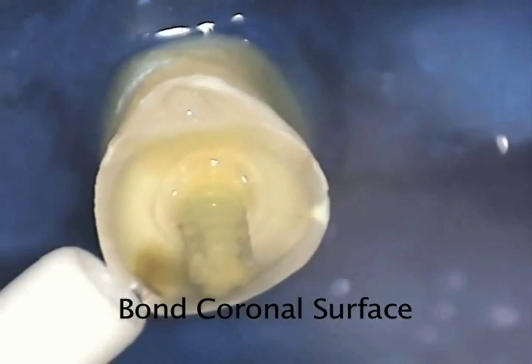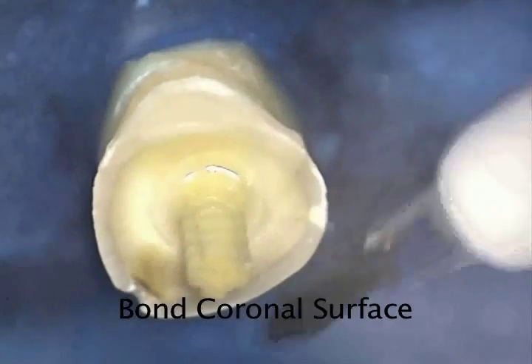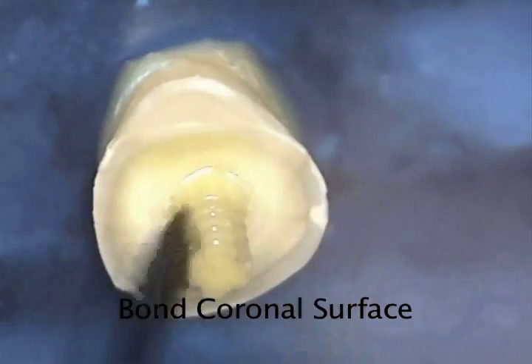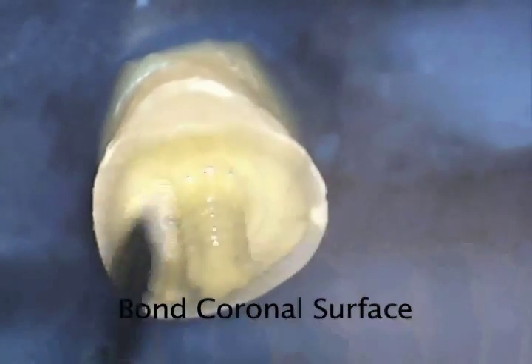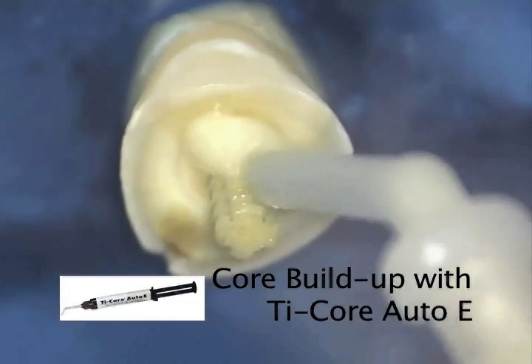We then mix the components of the bonding agent and apply the mixture to the coronal root surface. We are using a self-curing bonding agent, so we will let it cure on the root surface. We then express Dual Cured Ti-Core Auto E through a small mixing tip onto and around the post.